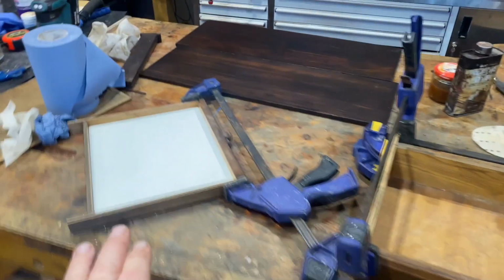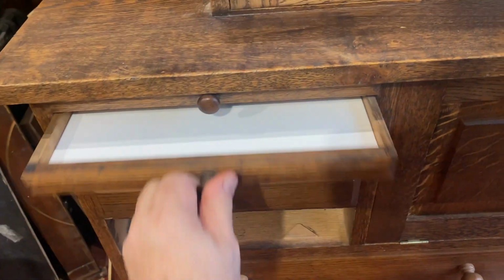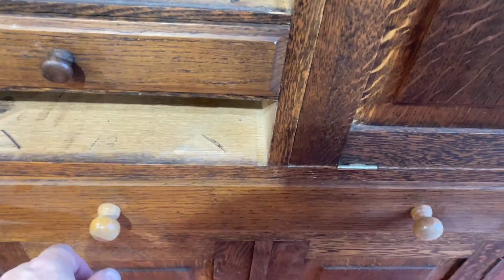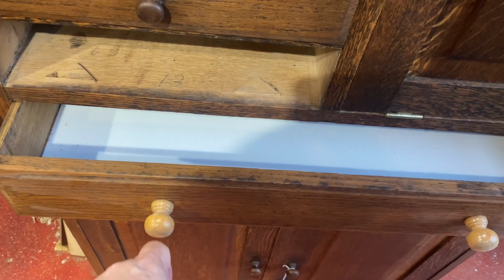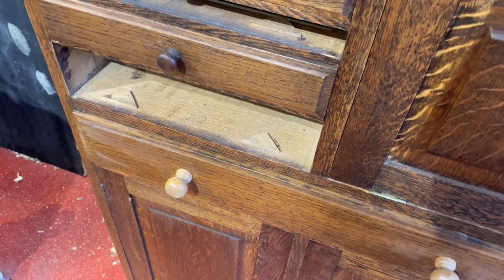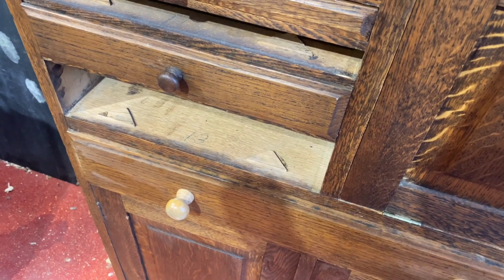So we've got these drawers drying. I've cleaned the glass. I've put some of the drawers back in with cleaner glass and shelves in. Still got to find a cover for that. But look at this. These are the handles on these drawers, and yet when we come down to this drawer, these are much more modern. They're lighter in colour and they're a different shape. So I want to do something to slightly adjust that. I'm not going to make brand new handles, but something to try and get them to be a closer match.